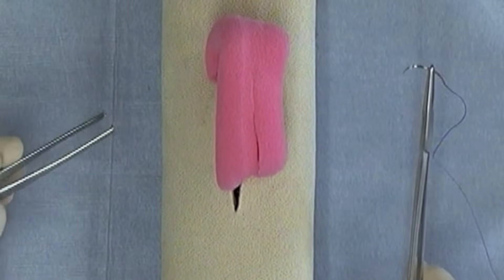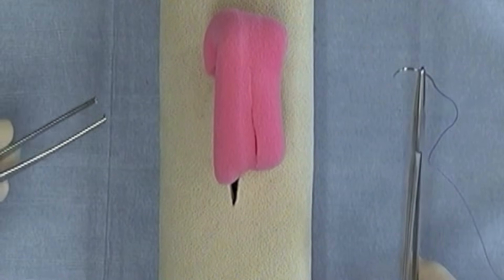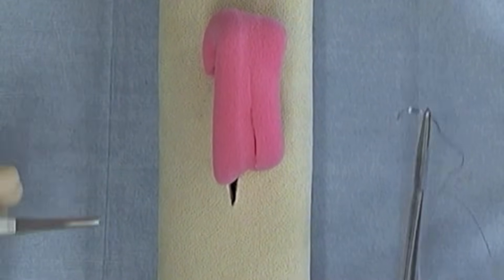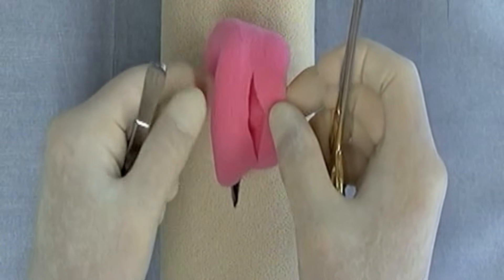To construct the Lembert suture pattern and all of the suture patterns used for viscera, you will need this portion of the daisy, which is the facsimile of the piece of bowel.